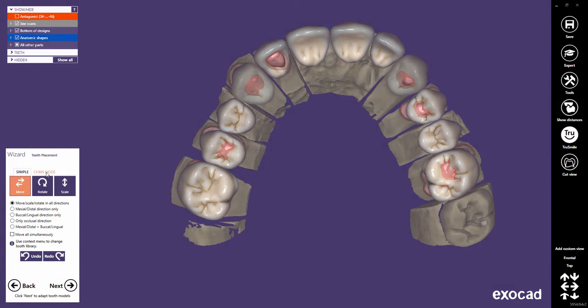This quick guide tutorial from ExoCAD shows the Chain Mode tooth placement feature. With ExoCAD DentalCAD version 2016, the Chain Mode feature is available in the Tooth Placement dialog, which appears in the wizard right after the Crown Bottoms dialog. The general tooth placement functions you should already be familiar with are still available in the Simple tab. These will be explained in a separate tutorial.